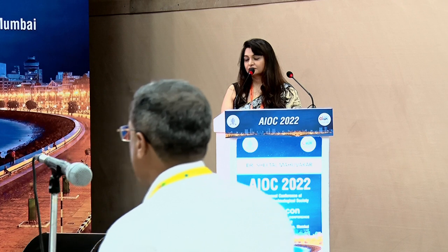Yes, yes, I agree. Is subcapsular fibrosis there, or is it capsular fibrosis? Subcapsular. I always thought it is, when you are doing, it's always at the capsular level. There's a very nice video by Dr. Deepak Megur. Okay. About this, you should see. But that is for fibrosis and calcified subcapsular plaque. So there are two different things. The calcified plaques are subcapsular. The fibrosis is at the level of the capsule. At that point, that is what I actually thought it was, at the level of the capsule, but I would certainly revise and review this case.